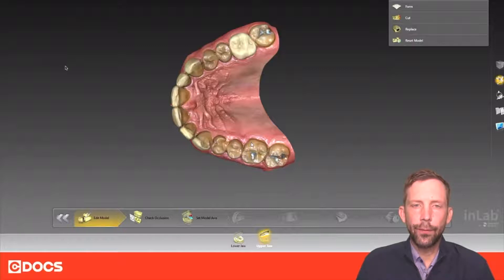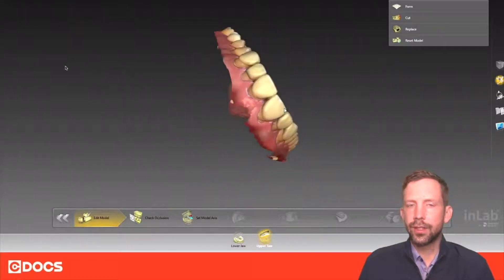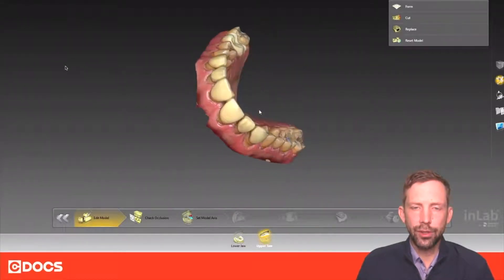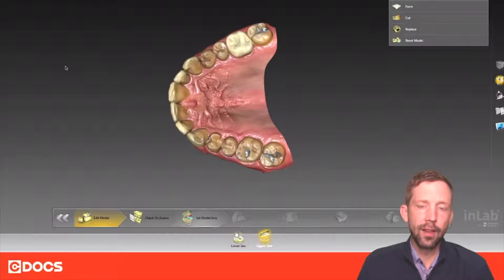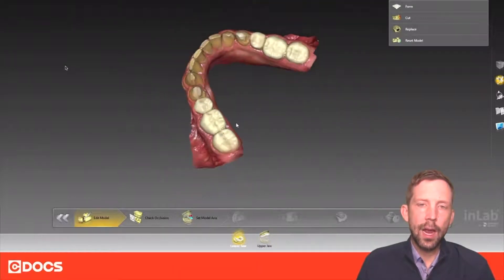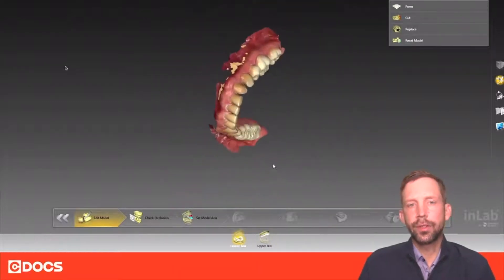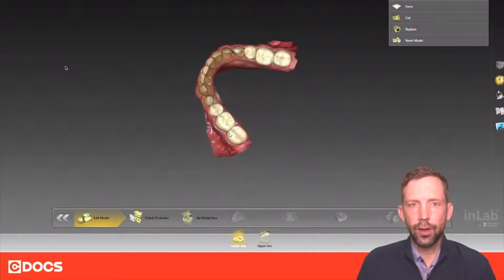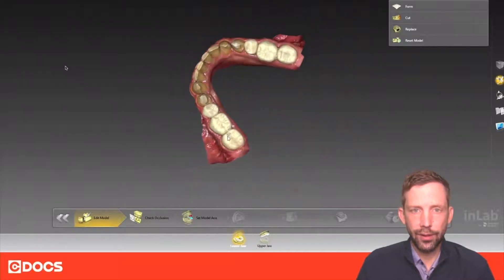In this particular case there's going to be just an upper and lower jaw that we scanned with the prime scan, brought it into InLab, and we're going to print some models just to do some diagnostic work for a full mouth reconstruction.